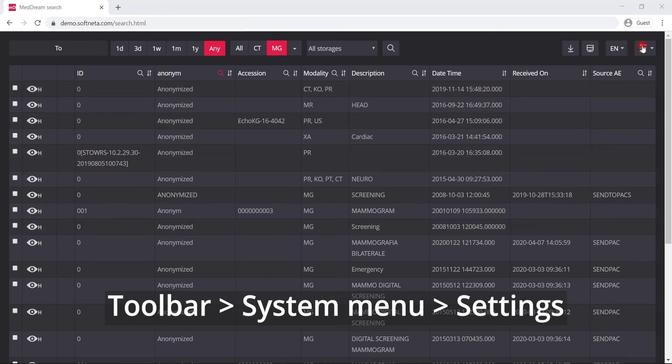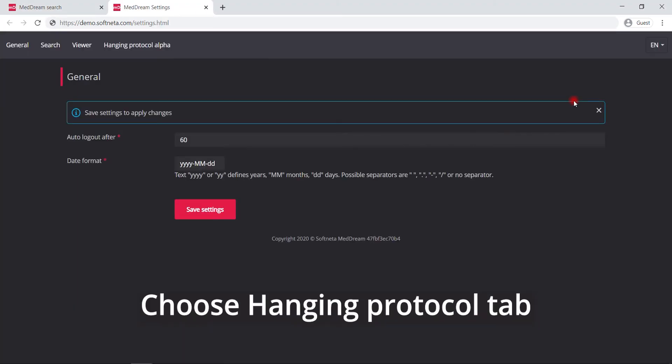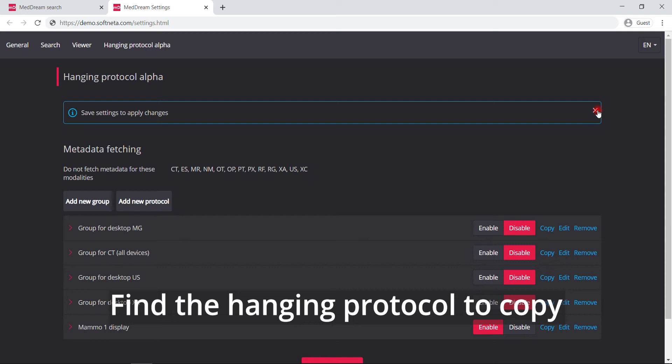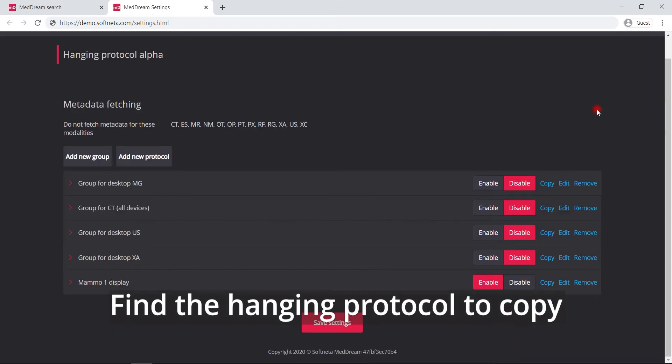Press the system menu button on toolbar and then click on settings. Choose hanging protocol tab.